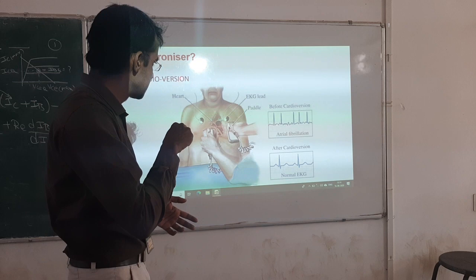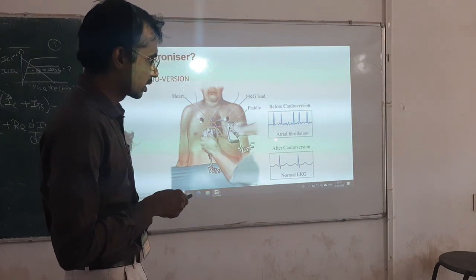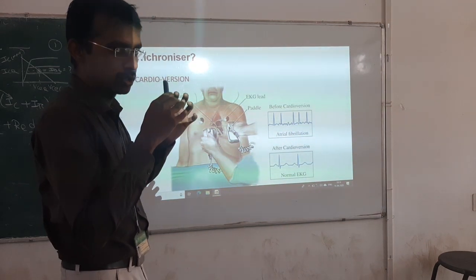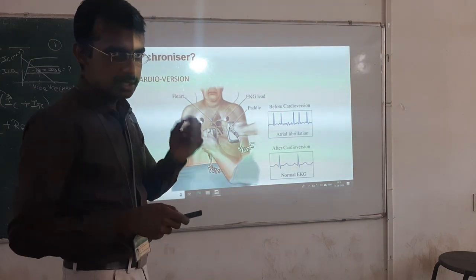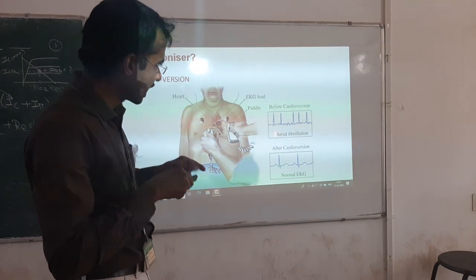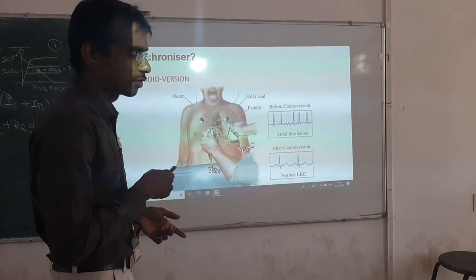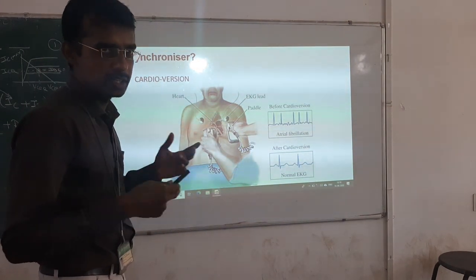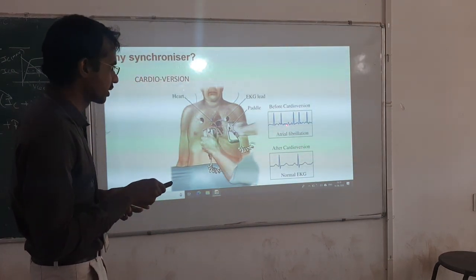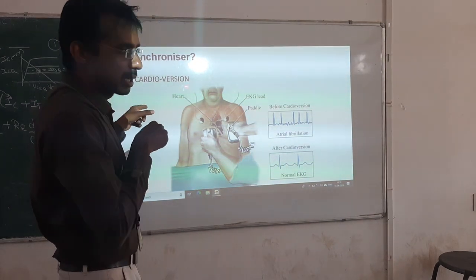It is simply a point in an irregular ECG waveform, not a proper ECG waveform. Now the patient is suffering with fibrillation, that is atrial fibrillation, where the atrium is struggling to pump. In that, there is a specific timing when fibrillation starts. At that particular point, when you try to give the shock, then it works out. They have found this cardioversion point by trial and error with thousands or millions of samples. The thing that matters here is that at the cardioversion point, you need to apply the shock.